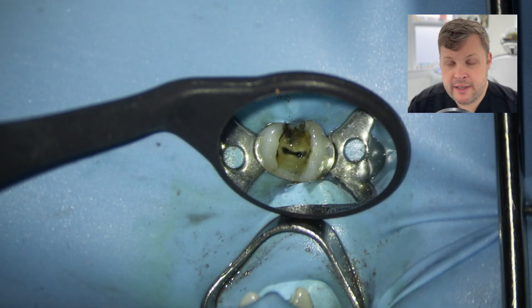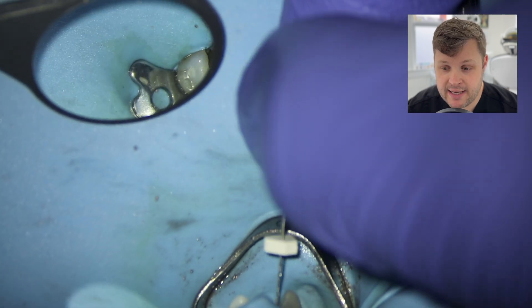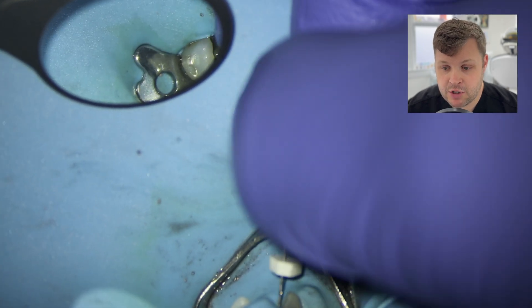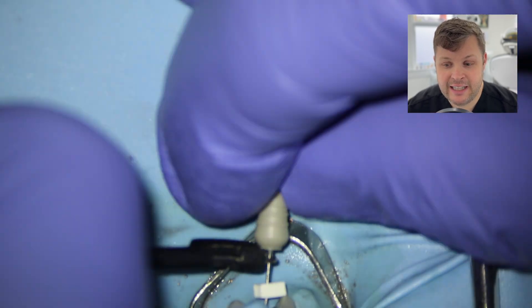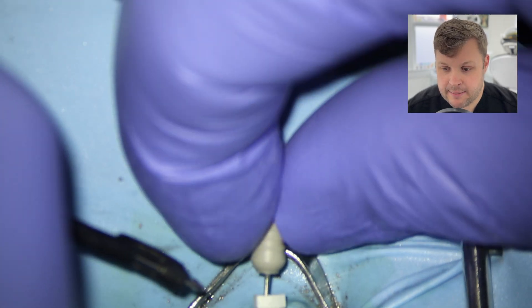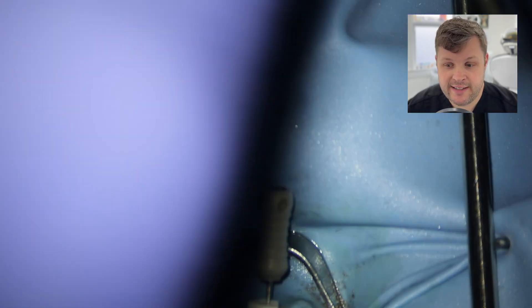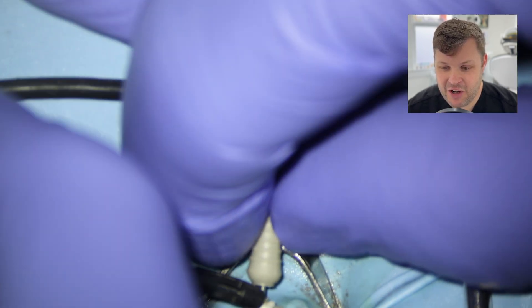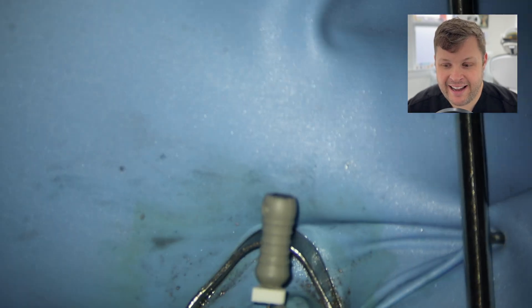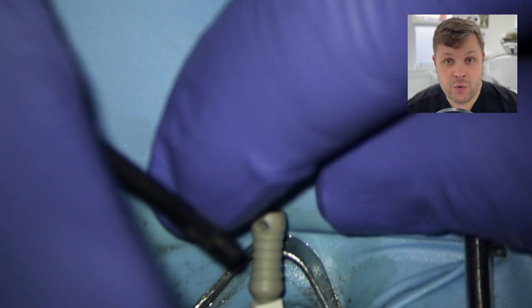To get around this, I'm going to use a smaller diameter D-Finder — a size 8 with a small bend at the end — and very gently watch-wind. I know instantly I've gotten a little further than with the size 10. I keep watch-winding and checking the apex locator, and I get to a point where I'm right at the end — I've managed to negotiate all the way to the apex.